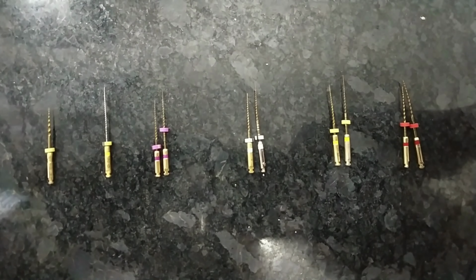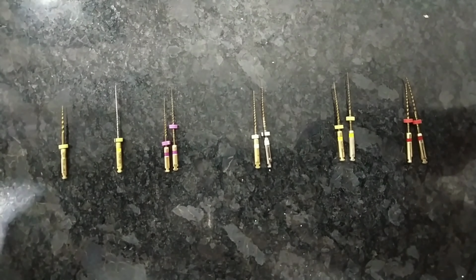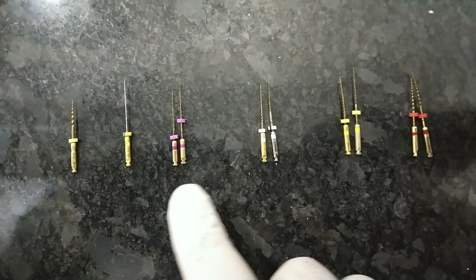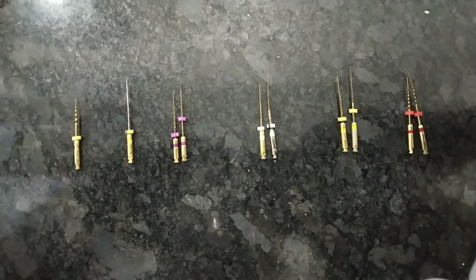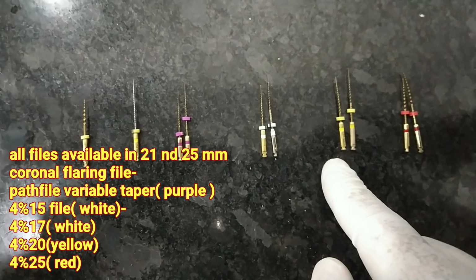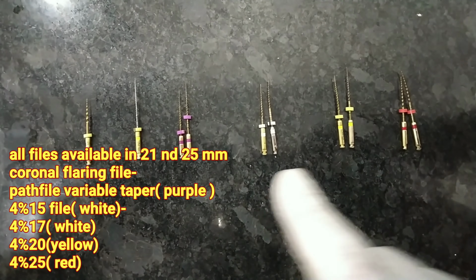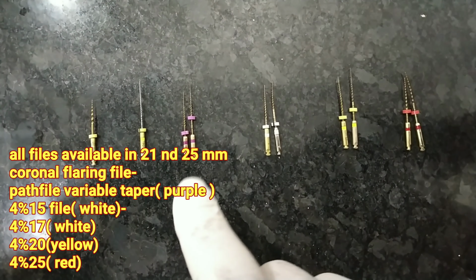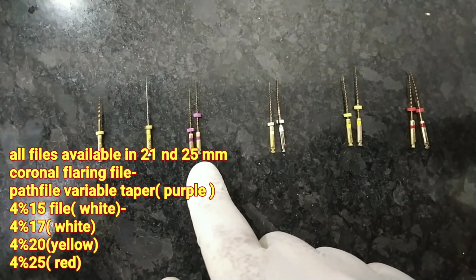So now here you can see a set of various files which are kept. So this is the coronal flaring file. This is the path file. This again is a path file. Then this is the shaping file. This is also a shaping file. This is also a finishing file. So you can use this sequence as we use in the ProTaper. The color coding is same, like purple, then white.